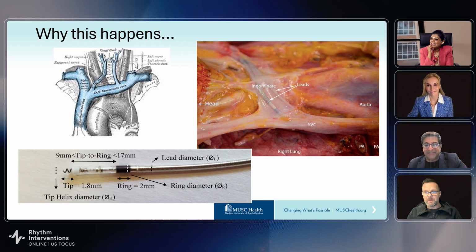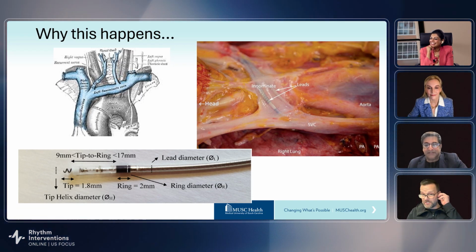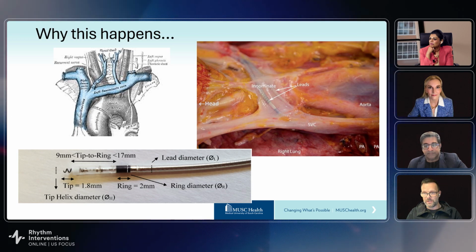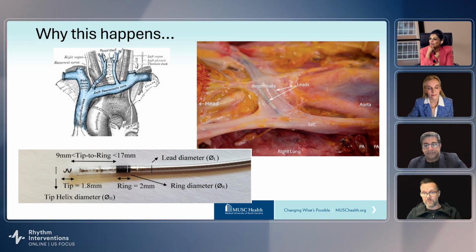I think you've got to be prepared to go all the way. If you're willing to pull on a lead, then you ought to be willing to prepare that lead, to put a locking stylet down it, to prepare the insulation, and to use whatever tools necessary to take it out. I don't think you should be pulling on it, and then at some stage, if it gets stuck, you're going to have to abandon it.